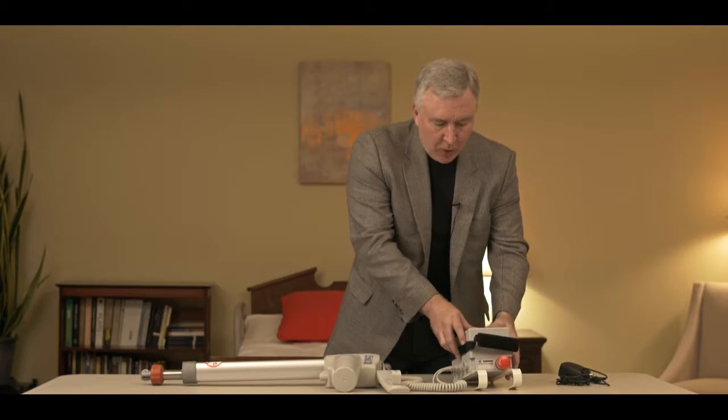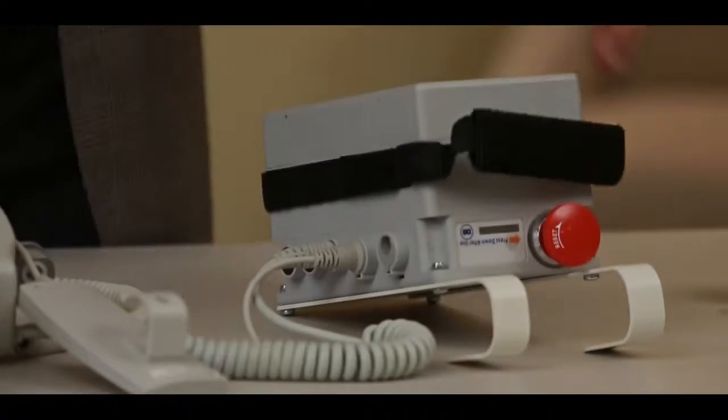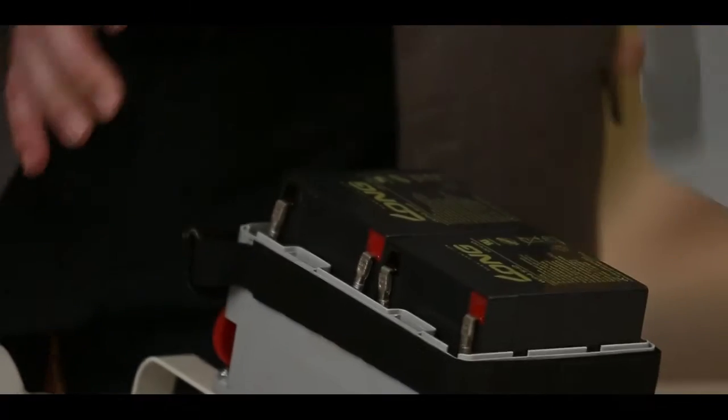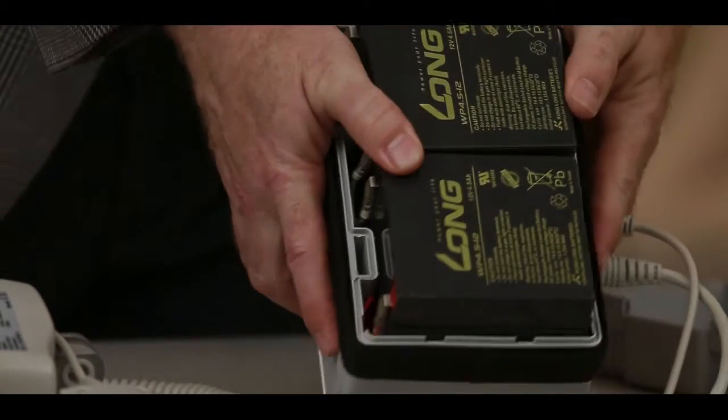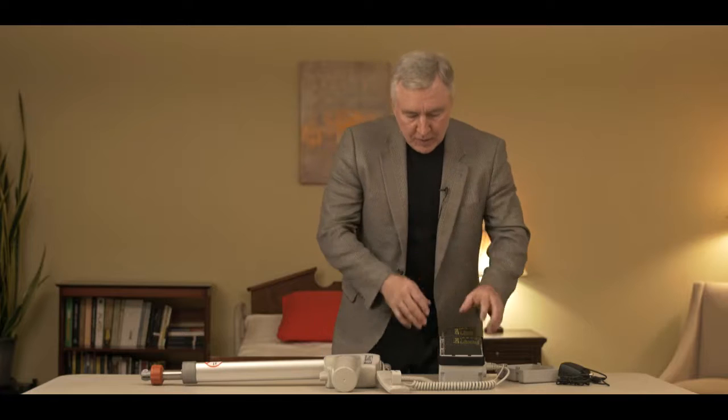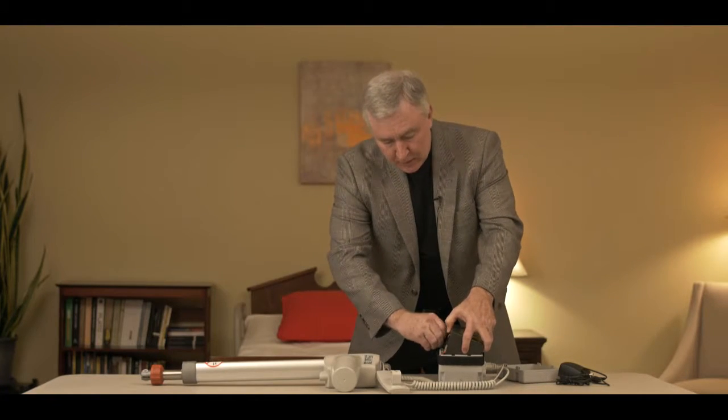As mentioned, this system has to be plugged in to charge. If you're not keeping it charged, you're going to kill the batteries and need to replace them. The batteries are quite easy to replace — there are two tabs on the control box that you can squeeze and just lift the cover off. Inside, you see two individual battery cells that are wired together. These batteries are available from BestCare or your dealer, or sometimes locally. The batteries are probably the number one reason the system fails, but it's very easy to have access to them.